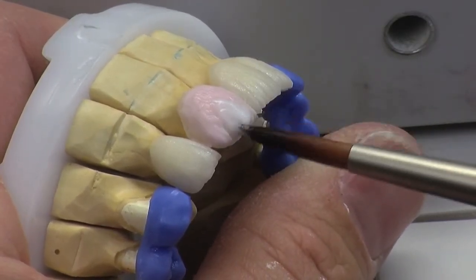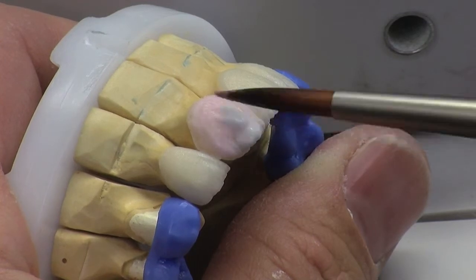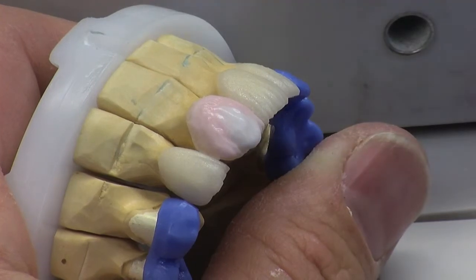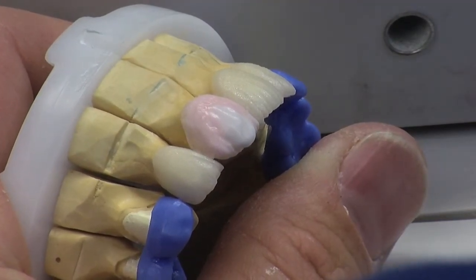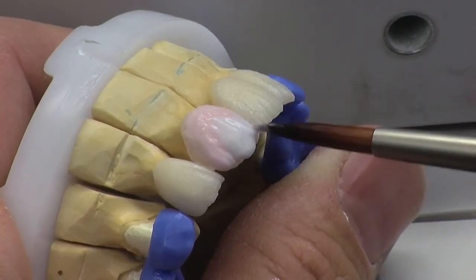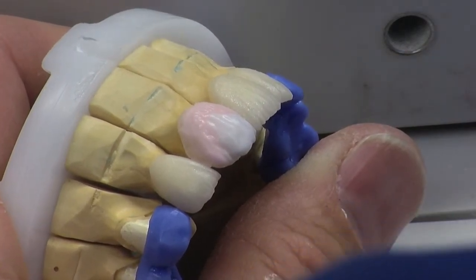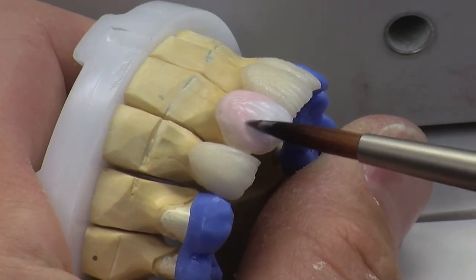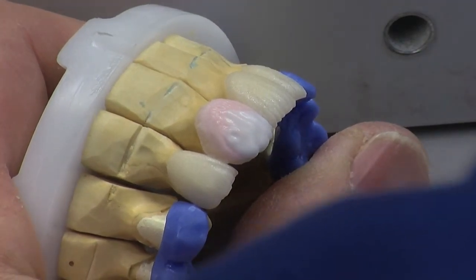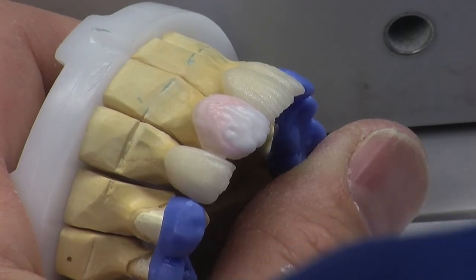Nice and straightforward. A little bit of TI1 with some clear. Now I'm going to use a little bit of straight BL in the mesial section there, and I'm going to be using OE1 for the corners, which gives us a nice bluey translucency in those corners.